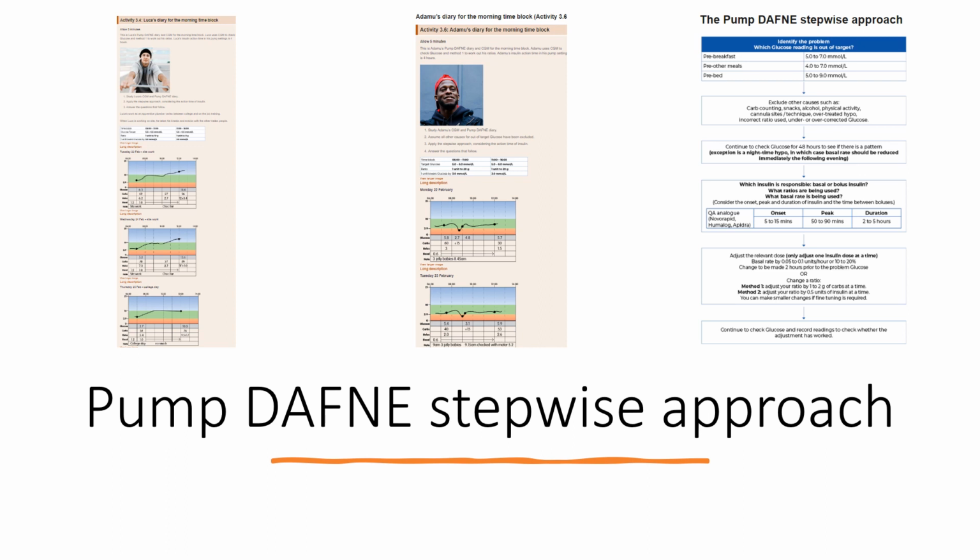This is a similar approach to MDI DAFNE when we focus the examples on particular meal times or overnight glucose management scenarios. Remote Pump DAFNE makes greater use of delayed or missed meals for basal rate checking in time blocks. We don't recommend carb-free meals in Pump DAFNE because of the possible effect of fat and protein on glucose.